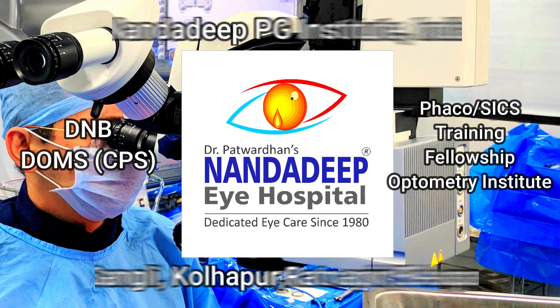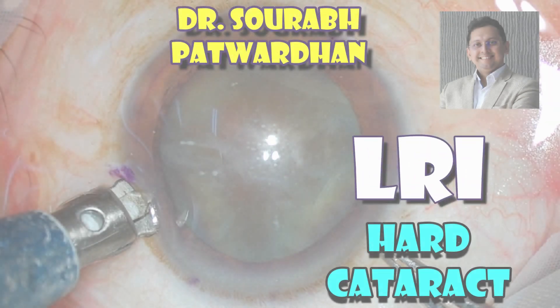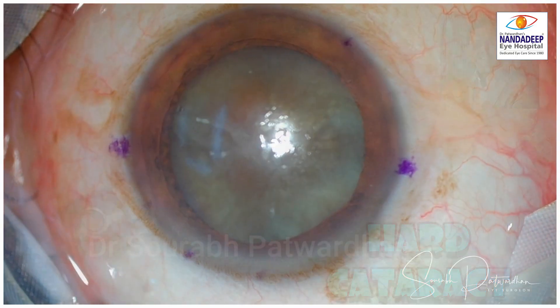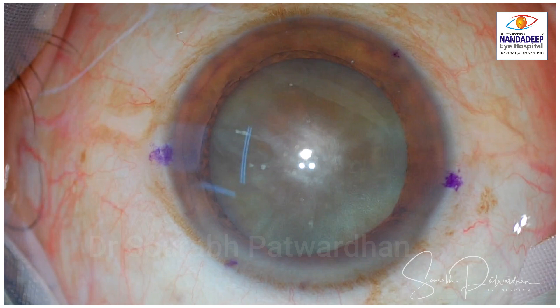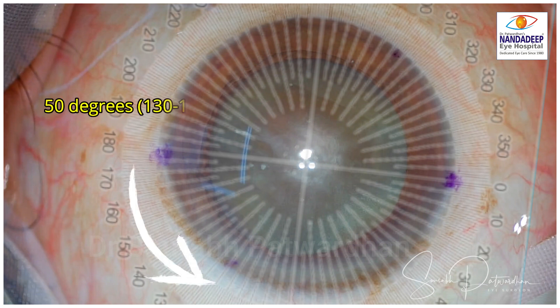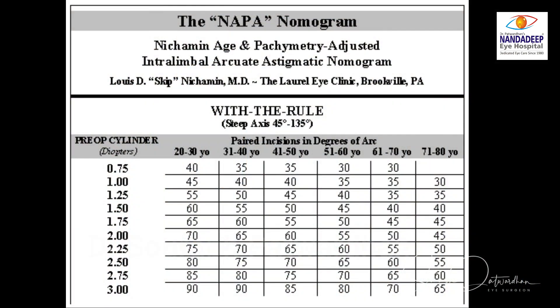In this video, I will be speaking about a case where I did LRI, which is Limbal Relaxing Incision, to take care of astigmatism and hard cataract. You can see I have already marked. The two marks are 0-180 degrees, and when you put a Mendez ring on the cornea, you can mark the arc for the LRI. This is a 50-degree arc from 130 to 180 degrees, chosen on the basis of the Napa Nomogram.